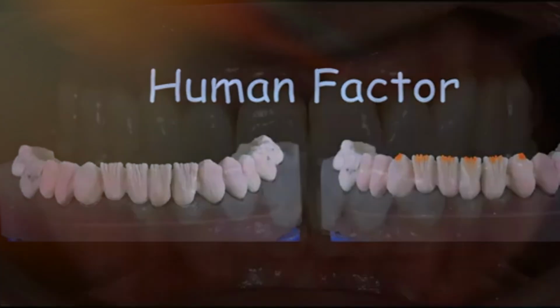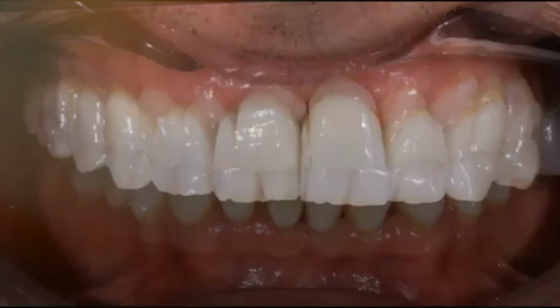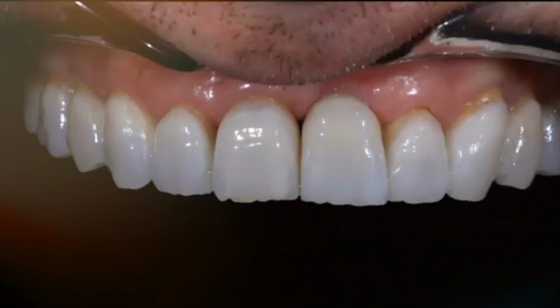And this is the final restoration after cementation. The final portrait.